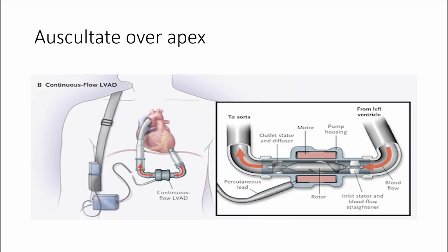Now, these pumps do not... there was a brief experiment. I can't remember if I talk about it now or later. There was a brief experiment with these pumps to see if they could produce a pulse, a pulsatile waveform like we feel. They thought that might reduce the incidence of stroke and the patient might tolerate it better physiologically. Made no difference and actually caused some other problems. So most, I won't say all of them, but most of the modern LVADs are a continuous flow device.